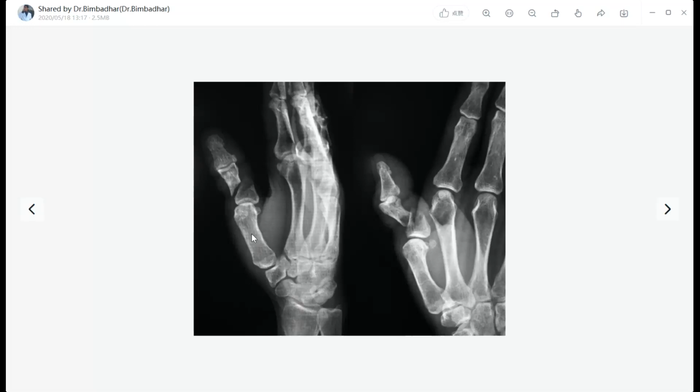So that's the reason always include at least the bones present proximally and distally to it. Always necessary. You understand? If Reshma had diagnosed it as the little finger, she would be operating on the little finger, but the problem is present down on the thumb. Did you understand? It's the biggest mistake done by a doctor.